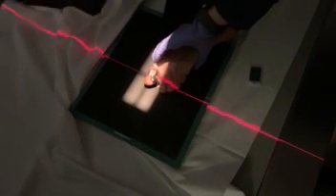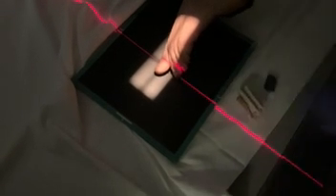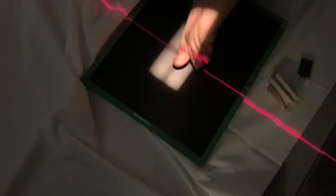Daniel, can you scoot your hips back a little bit? Yeah, then turn your hips all the way. There you go. Good. I'm going to turn your foot all the way. See, we might better do it without it. Okay. All right. There you go. Perfect. Right? So yes, this is horrible for the patient. So try not to keep them here for too long.